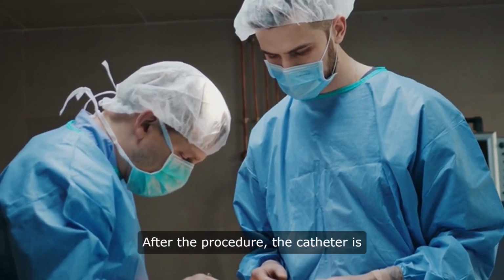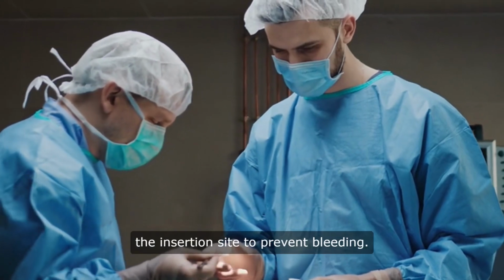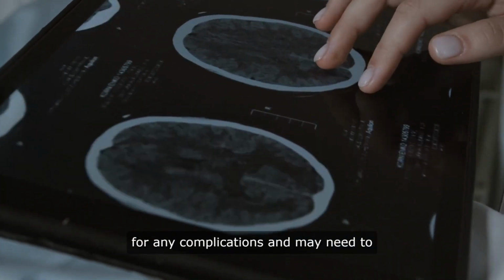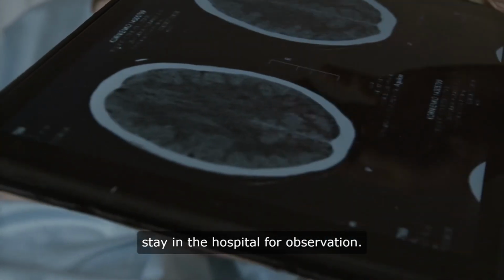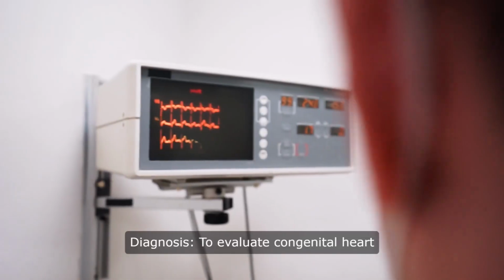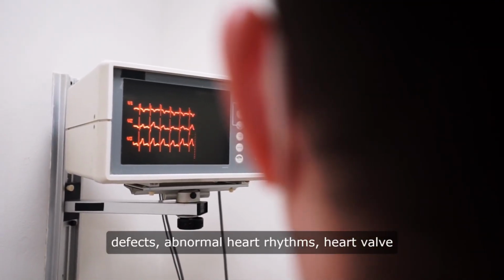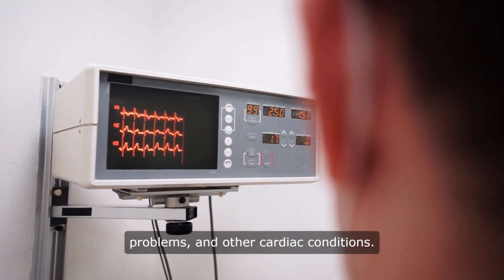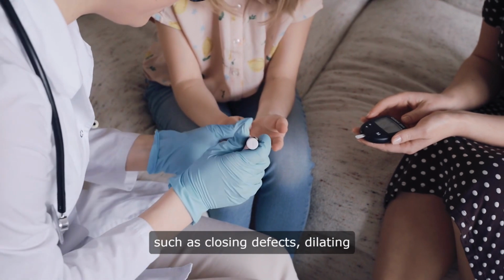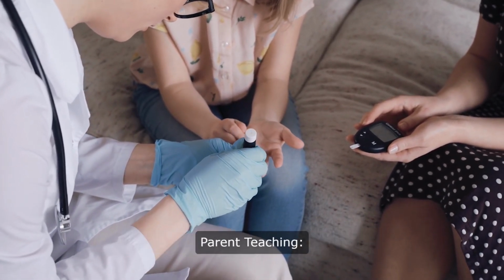Post-procedure care. After the procedure, the catheter is removed and pressure is applied to the insertion site to prevent bleeding. The child will be monitored closely for any complications and may need to stay in the hospital for observation. Indications. Diagnosis. To evaluate congenital heart defects, abnormal heart rhythms, heart valve problems, and other cardiac conditions. Treatment. To perform certain interventions such as closing defects, dilating narrow blood vessels, or placing stents.